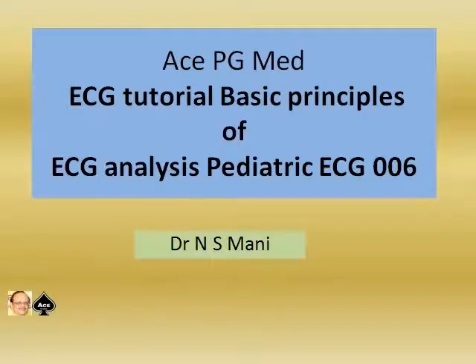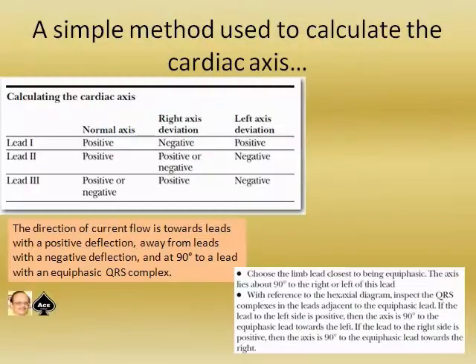I am Dr. Nasmani, and this is the sixth part of the ECG analysis of Pediatric ECG. Hope that you have enjoyed the previous sessions. Now we stopped with the calculation of cardiac axis in the previous session. So just start from where we stopped.